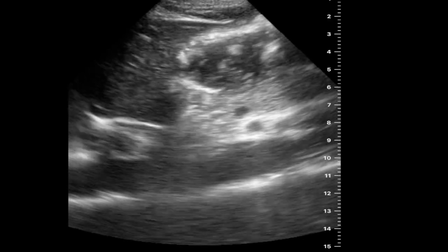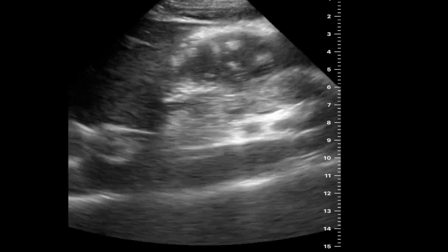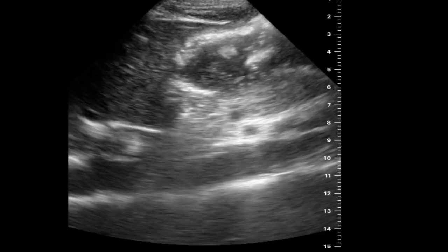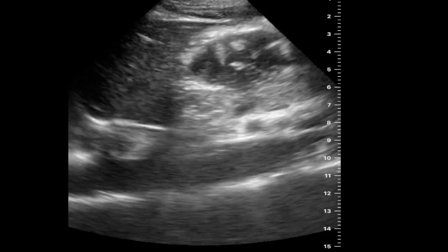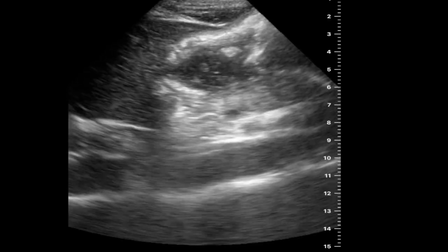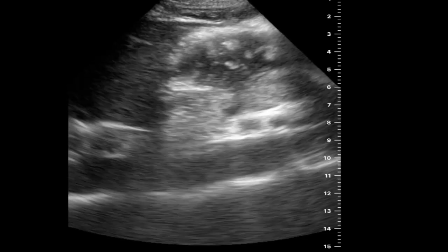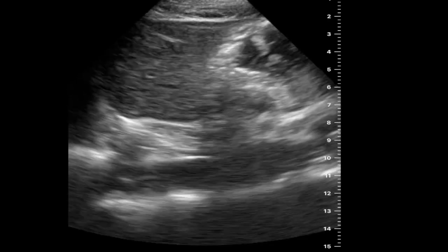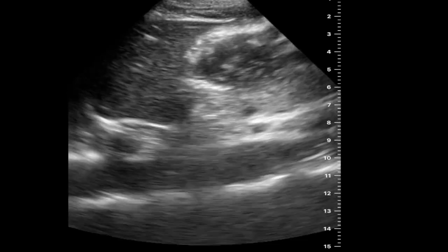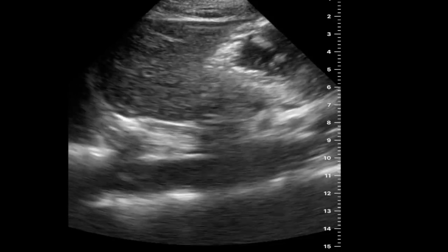Compared to an empty stomach, in panel B, a distended stomach is visualized with an admixture of anechoic liquids and hyperechoic solids floating within the liquid. This ultrasonographic evidence of thick particulate fluid or solid content within the stomach suggests possible incomplete gastric emptying. This condition could be due to a recent meal where the stomach has not had sufficient time to fully empty, or it might indicate prolonged gastric emptying time, potentially due to underlying gastrointestinal motility issues.